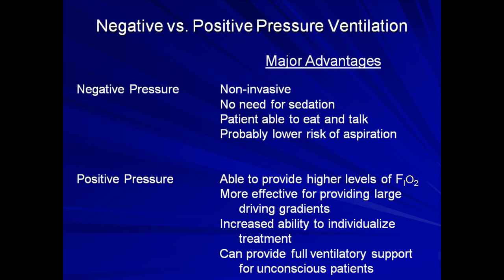The bottom line is that negative pressure ventilators were a near perfect solution to dealing with large numbers of children with polio and subsequent diaphragmatic paralysis. The patients are cognitively intact and with normal lung parenchyma.